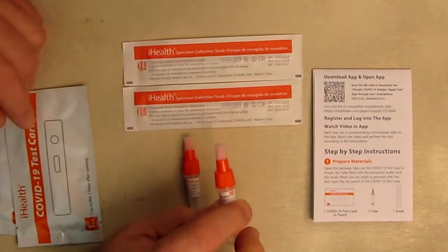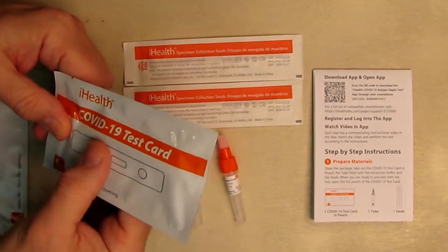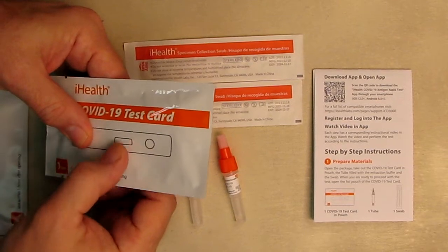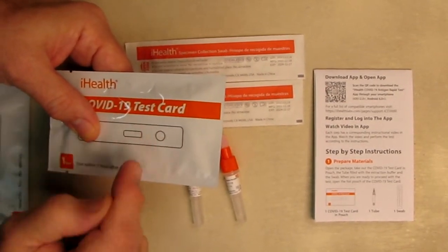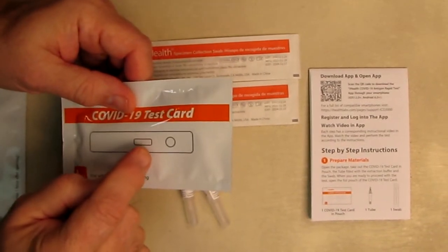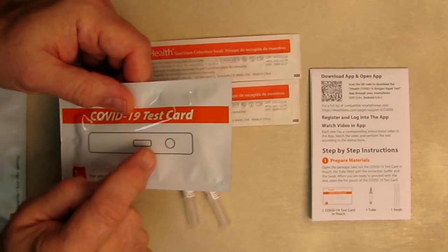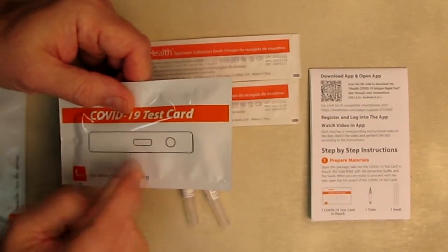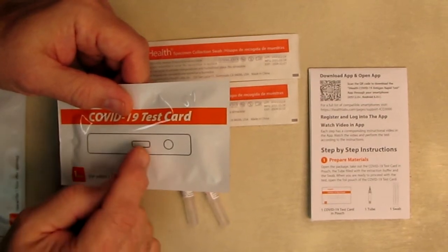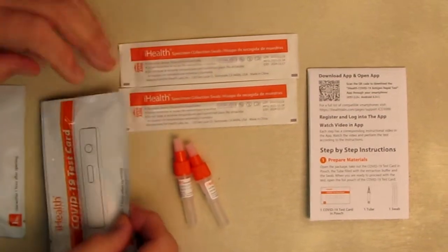You put the swabs into these little canisters and squeeze them out — the canister is very pliable. Then you use the actual COVID-19 test card, where you put the drop in and watch the results to see if a line appears. That line could be very small or very light. The first position is just a control locator line; the second one tells you whether you have COVID in your body or not.